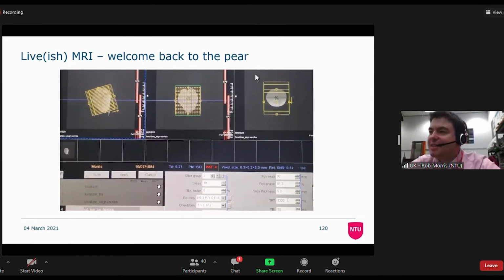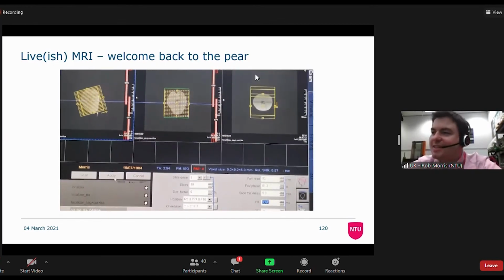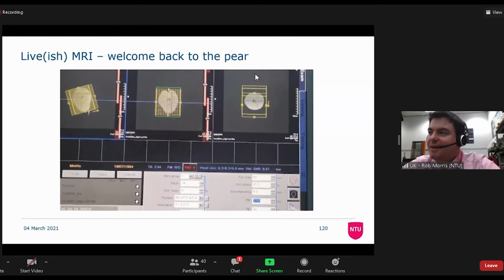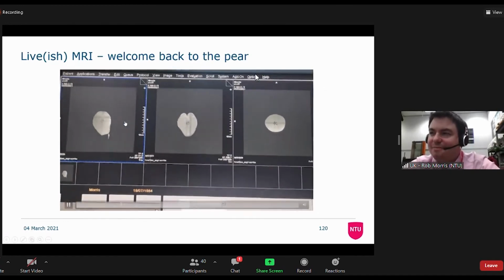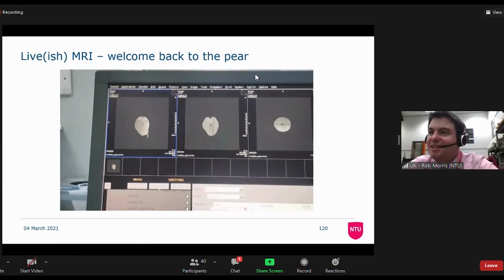So we're just going to make that a sensible time. So that's now 3 minutes. We'll hit apply eventually. Come on, there we go. And now you'll hear it run the scan. We'll pop into the magnet hall so you can actually see what's going on.